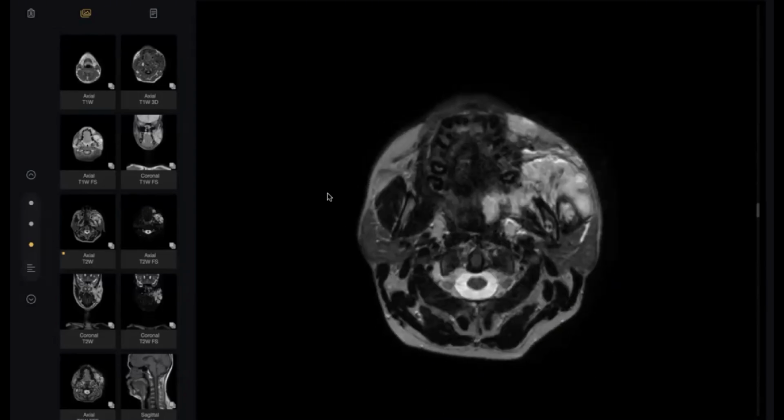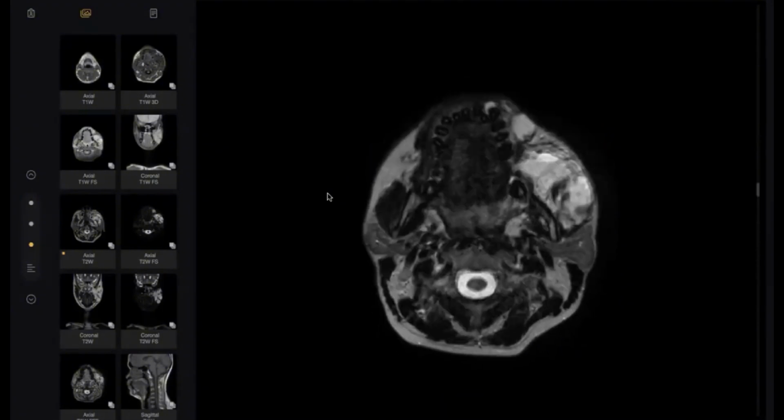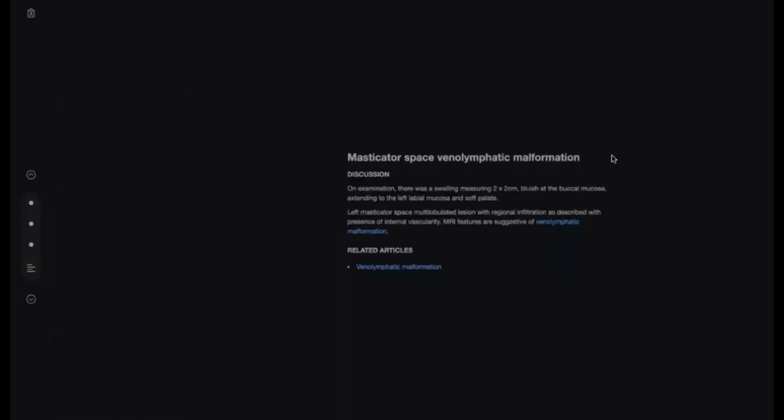What else? Neither between the artery and venous. What else? I think both will show phlebolith or calcification. No, no. Malformation is malformation. Hemangioma is a tumor, whatever the type. Hemangioma is a tumor that can be benign, locally aggressive, and malignant, like angiosarcoma.